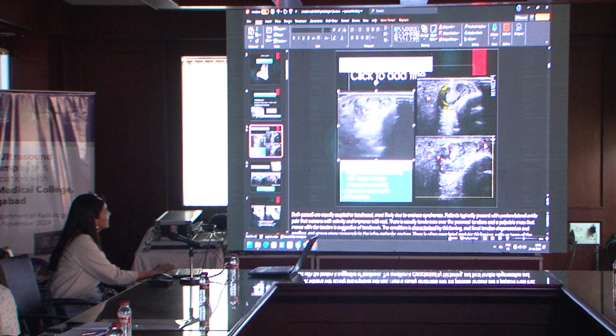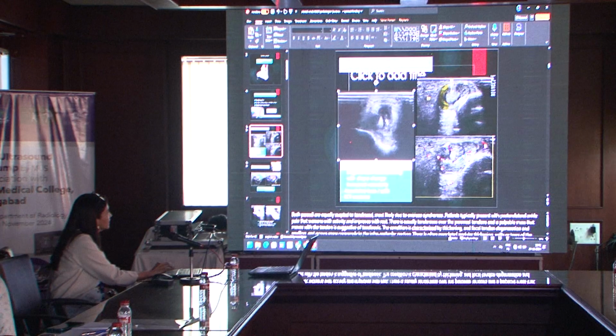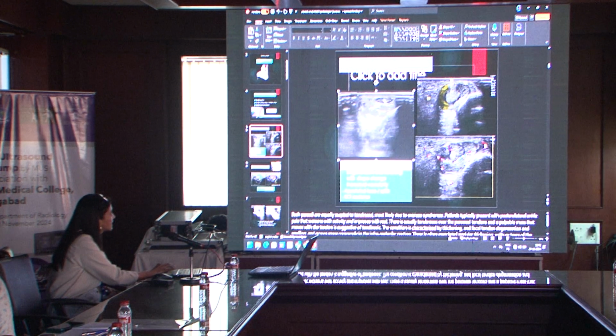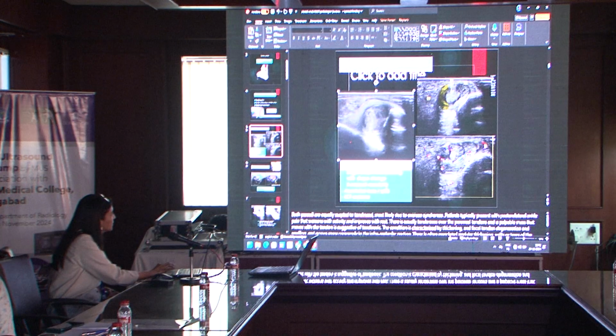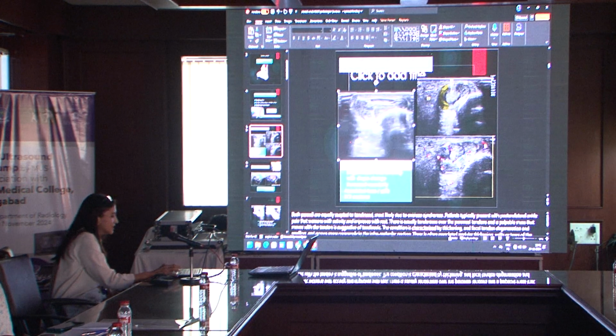See, when we look at the peroneus brevis tendon, there is more of muscle that we see, and then there is tendon formation. The peroneus longus tendon forms a tendon long before the peroneus brevis. So that's the brevis and that's the longus. The deformity that we see here is the softening and deformation of the shape of the peroneus brevis. There is a little bit of fluid accumulation and increased vascularity. So that's the tendinopathy.